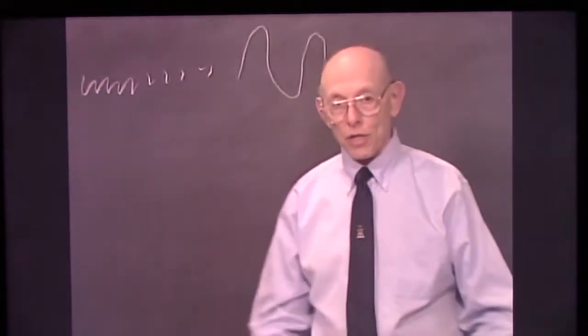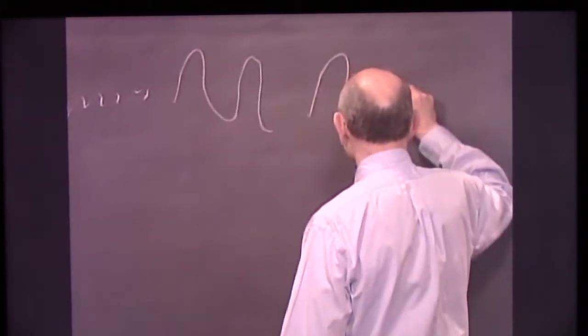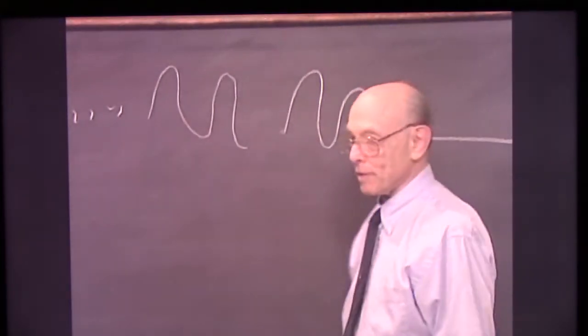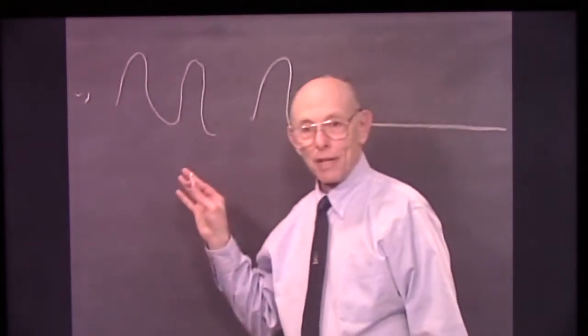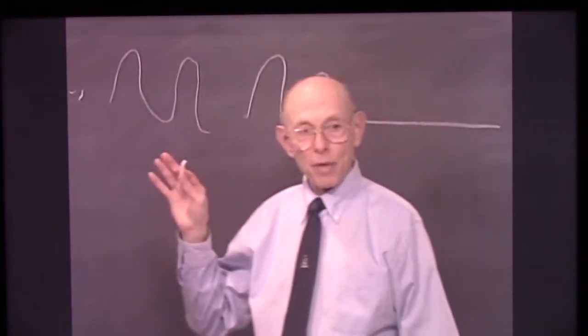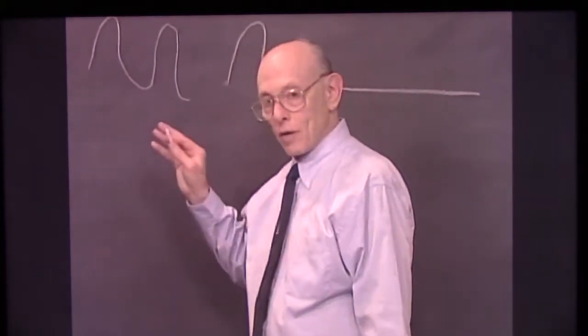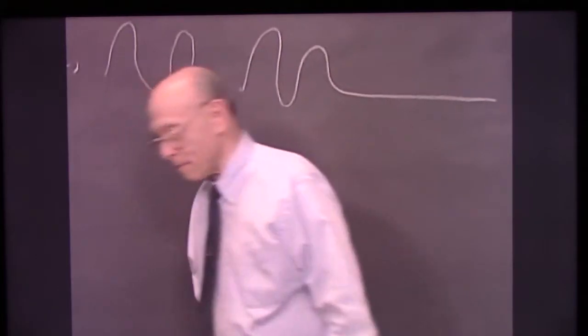They get slower and slower until finally they don't do anything, and you get burst suppression. And anyone, in fact, can look at an EEG and get some idea of where you are in terms of anesthetic depth, just with this simple concept in mind.